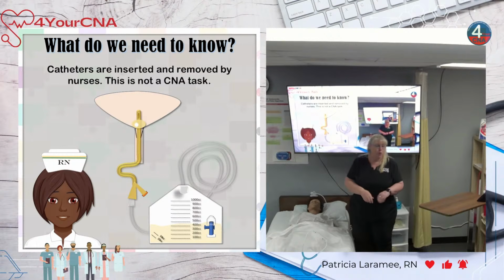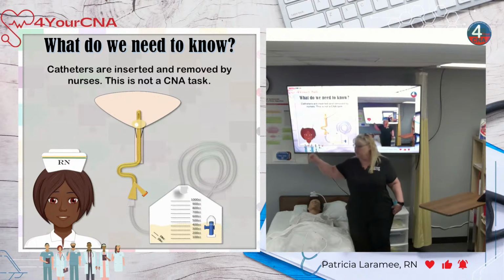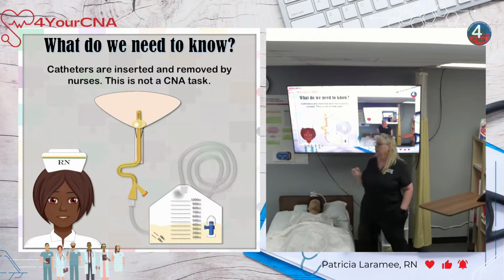So if you work in pre-op before they go to surgery, you're probably not going to have anything to do with the catheters other than sending the patient to the bathroom before we put the catheter in. I mean, you're not really going to have much to do with this. But if you work in the post-op section, I may want to train you to take out catheters. These are stable patients. We're getting ready to send them home in like 5 minutes, right? So you might be trained to take out a catheter because this is a routine task on a stable patient. Good? Make sense? Okay. All right.